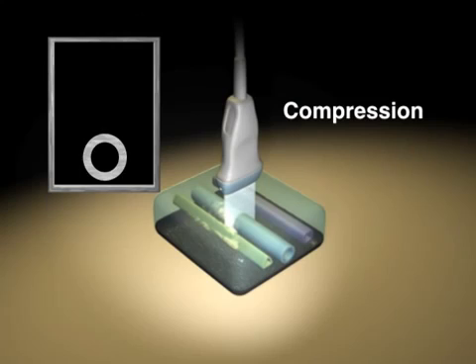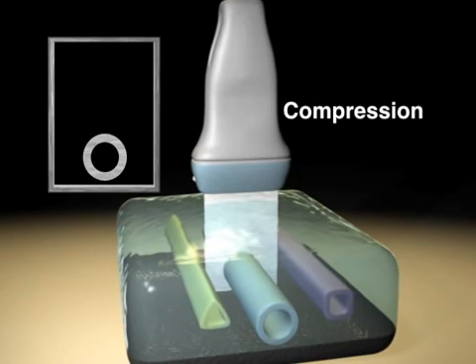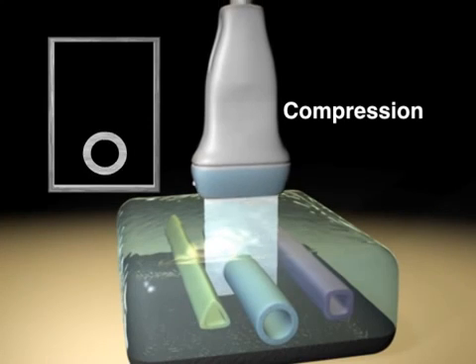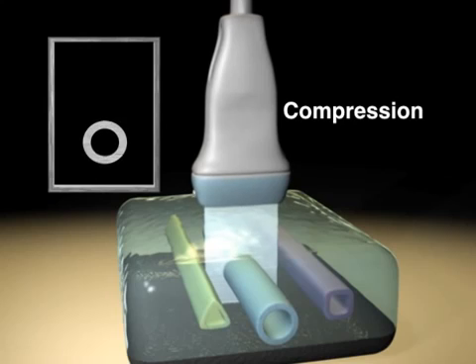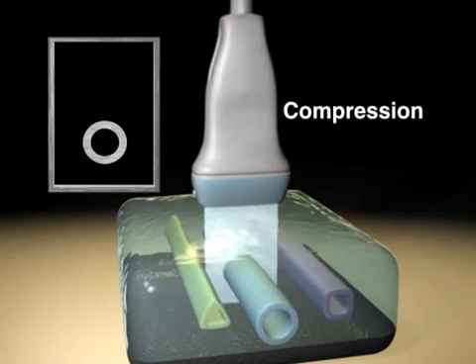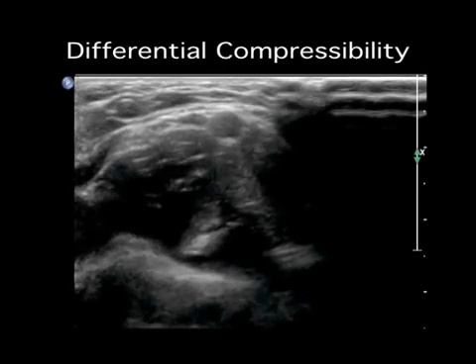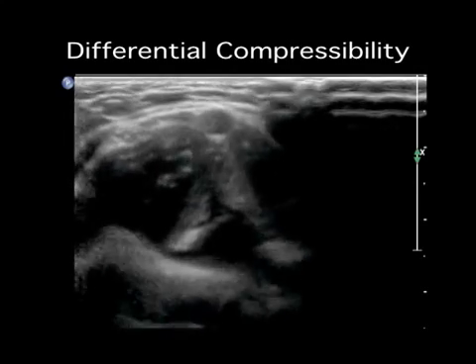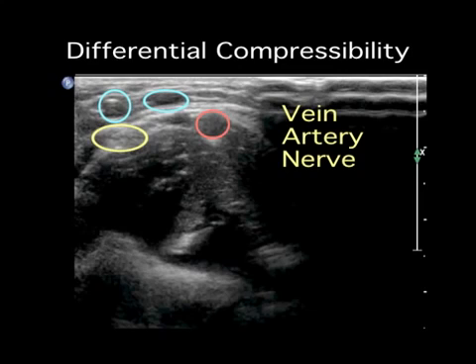Compression is a useful maneuver that has numerous effects. First, it moves the active face toward deeper structures to make them appear more superficial. It also helps differentiate between different structures by their relative compressibility. Veins are easy to compress, arteries are somewhat compressible and pulsatile, and nerves are fairly incompressible.